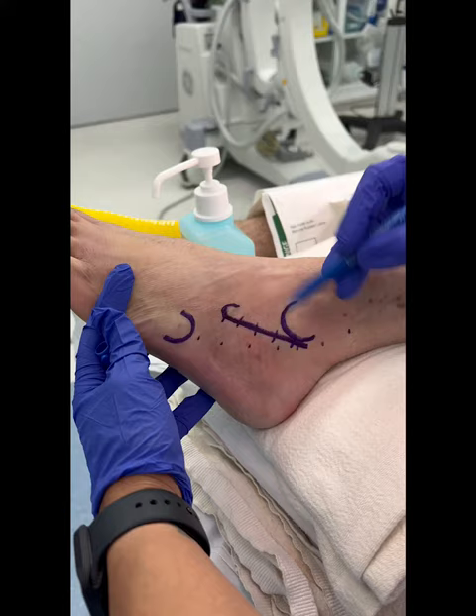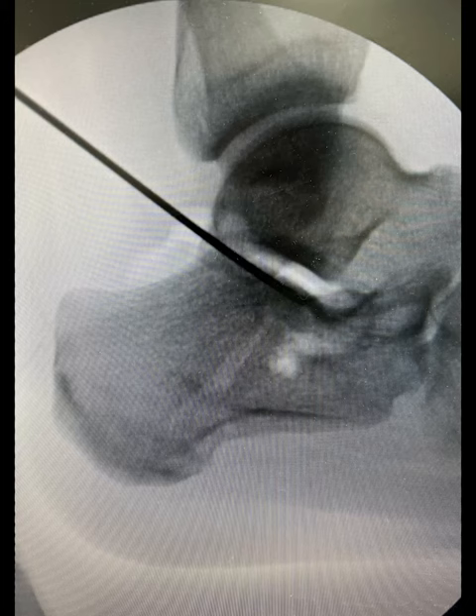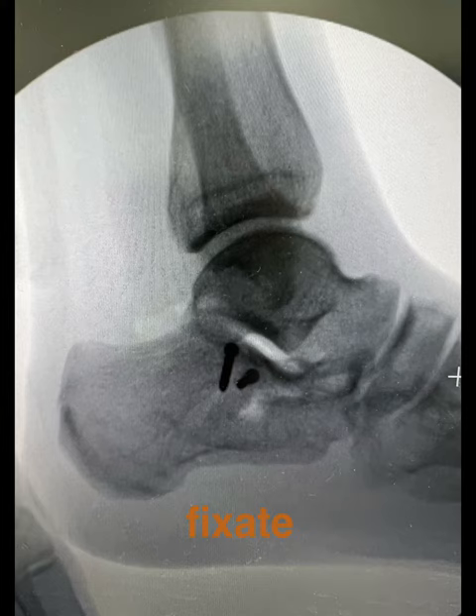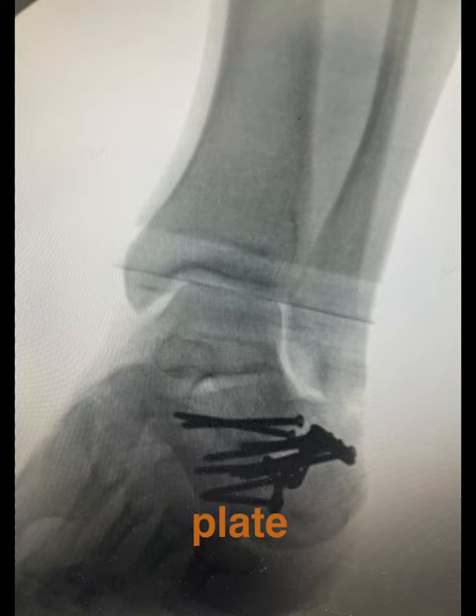That'll allow me to slide the plate here and fix everything. Once the articular surface is reduced, it's then fixated, followed by the application of a plate at the lateral aspect of the calcaneus through the incision site.